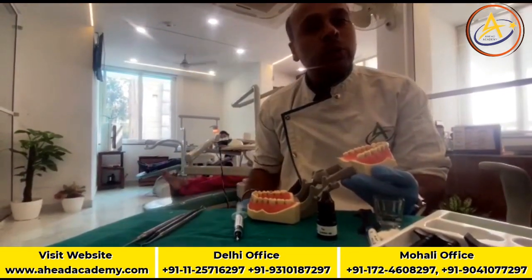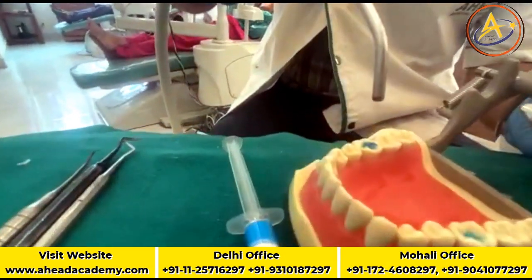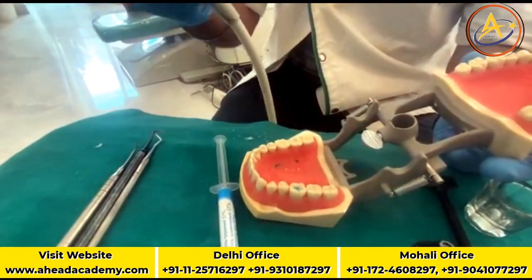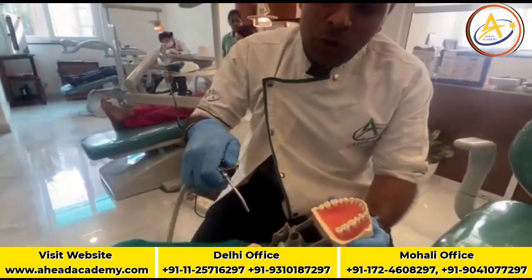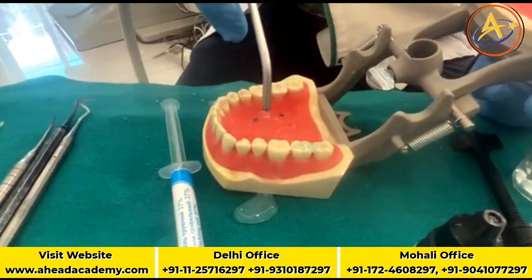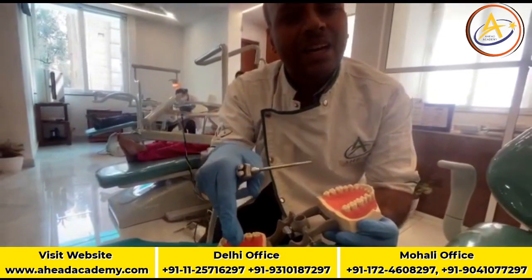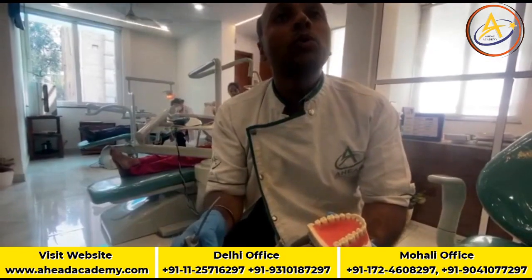And then after 20 to 30 seconds, you are going to wash this etchant with water. See how some operators wash: they just apply a little water, okay, done, and straight away dry the surface and start applying the bonding agent, which is absolutely wrong. What will happen if you apply just this much water? Clinically, you will see there is no etchant now, but microscopically, the etchant has gone inside the dentinal tubules. And if this etchant remains, it will result in post-operative sensitivity.